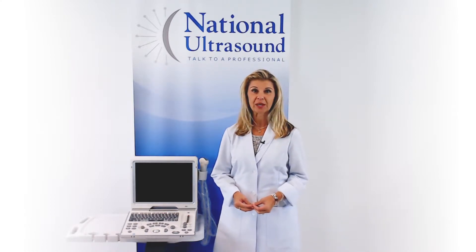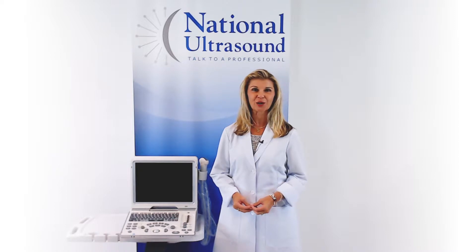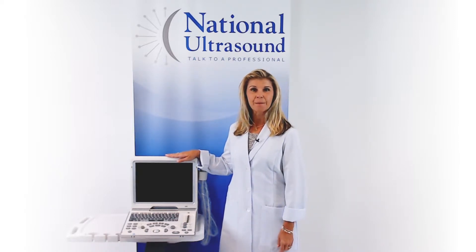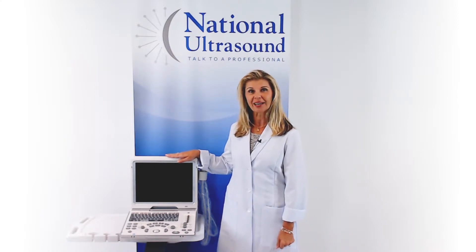Today, I am reviewing the Mindray Z6 color ultrasound machine. The Z6 is best used for general imaging, basic cardiac and OBGYN applications.